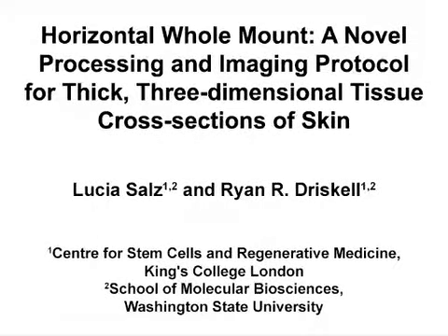The overall goal of this histological and imaging protocol is to present a robust system that preserves the epitope antigenicity and structural integrity of skin, which allows for full exploitation of confocal imaging modalities.